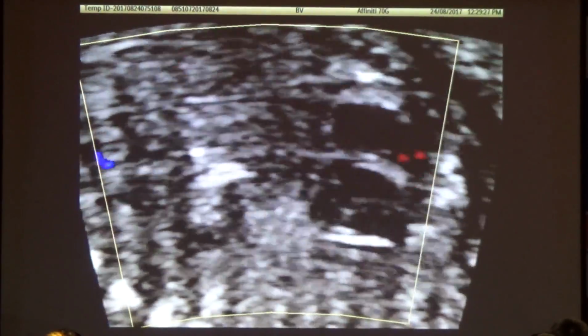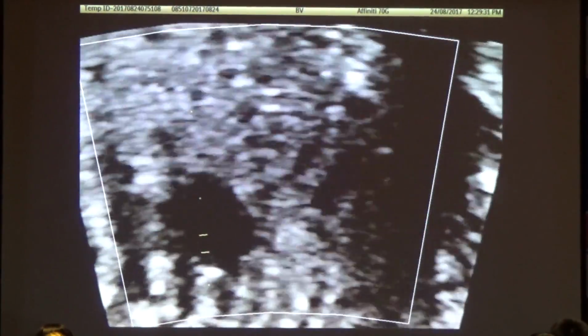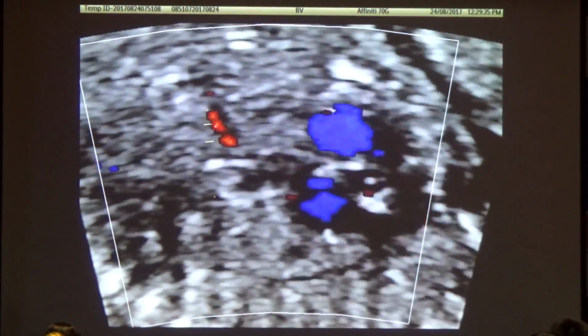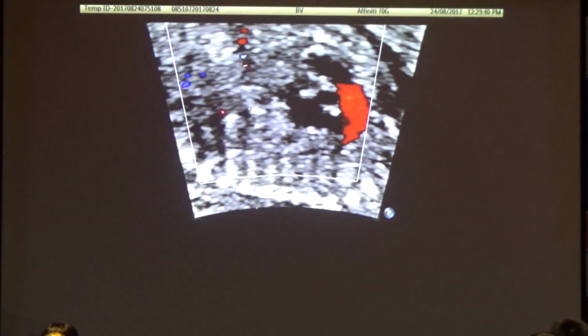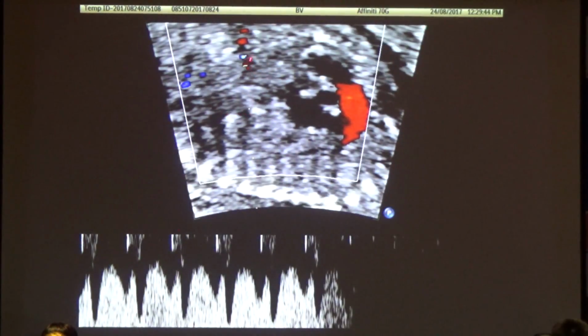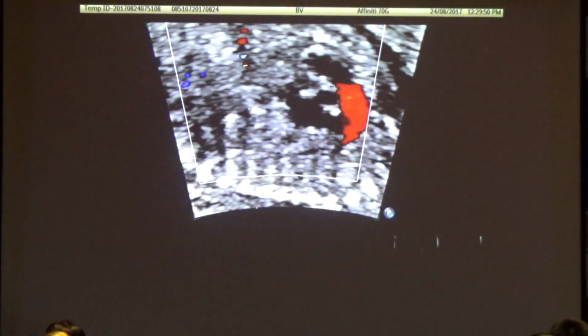Wow. Now, where's the Doppler thing quickly? Pulse is there, eh? All right, now. So now that I've bent down and I've looked what I'm doing, I've lost it. There. Okay, now a Doppler again. Doppler for me, please. Perfectly normal Doppler. Okay, fine. Very good. Thank you. Well done. Go away. Stay away from doctors. Okay? All right.